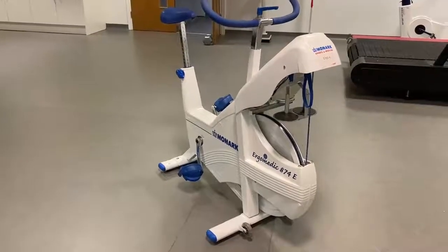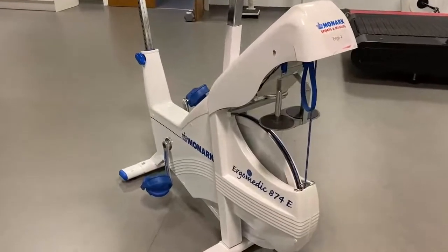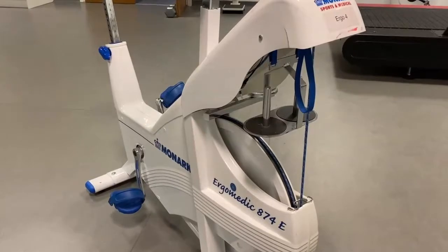Here in the lab you will predominantly use a Monark to conduct exercise tests. You can see your Monark is different to a traditional exercise bike in that it is classed as a rope brake cycle ergometer.